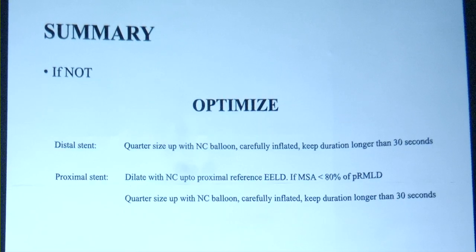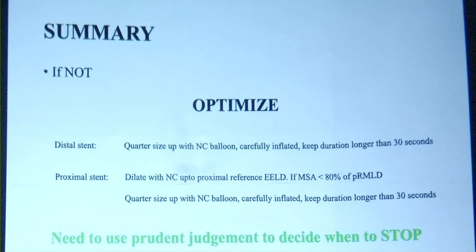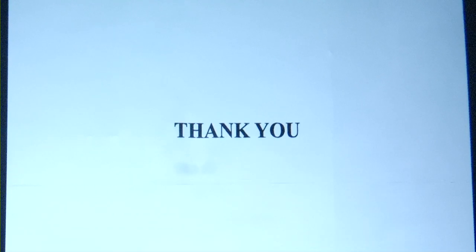If not, then you optimize by quarter size increasing the balloon diameters. At some point, you should use your judgment and stop instead of just using the numbers on the screen. And if you do this, I think you will help your patients. I have learned this quite late in my career, for the last 5 years, but systematizing your approach to coronary intervention using imaging is probably the final frontier, in my opinion, for making it as safe and effective as possible. Thank you.